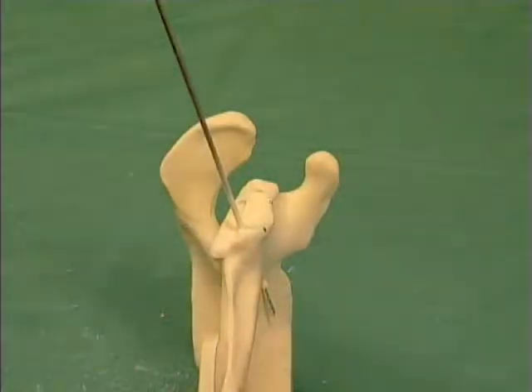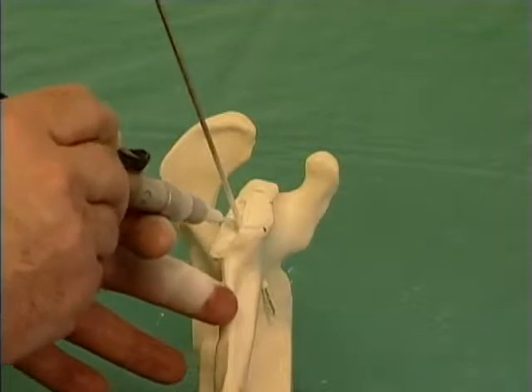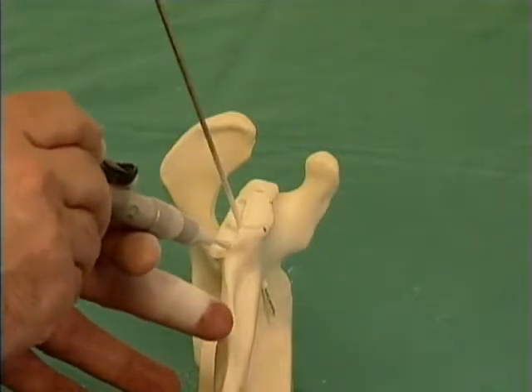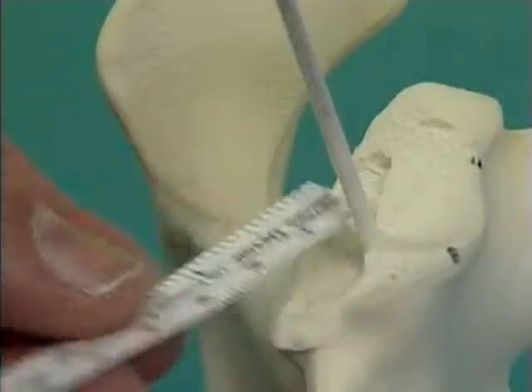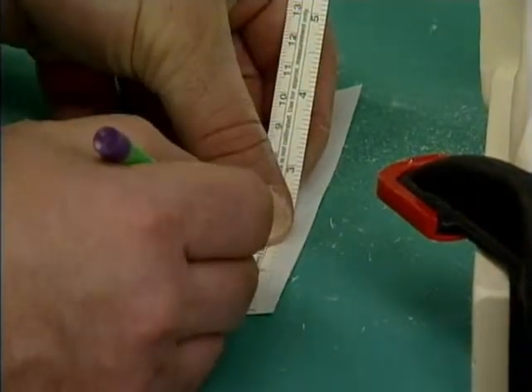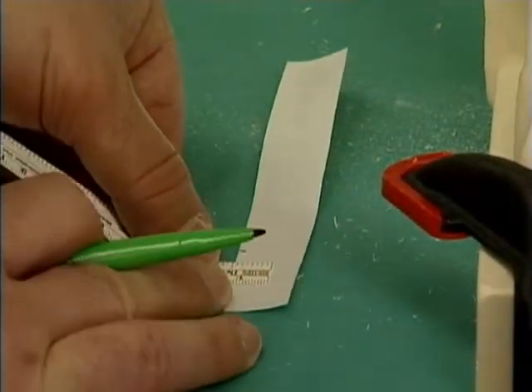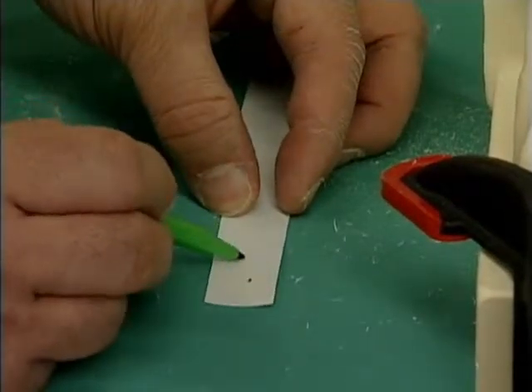This allows for a symmetric bed for placement of the graft, which is obtained from the resected humeral head. The defect in the posterior glenoid is then measured both in its superior, inferior, and medial-lateral dimension. This is then marked on a sterile piece of paper and traced out and cut as a shape.